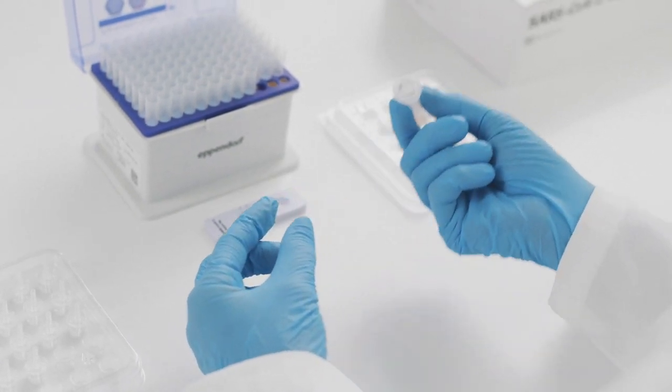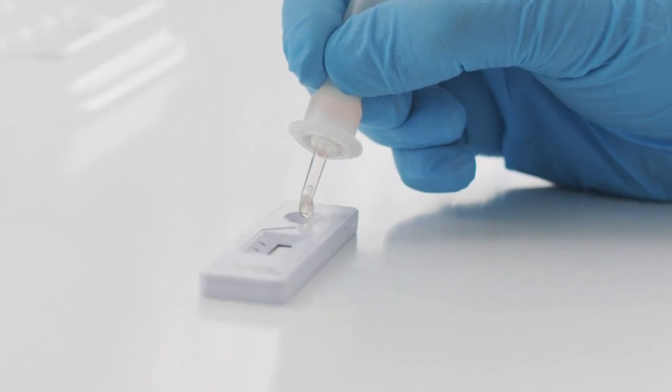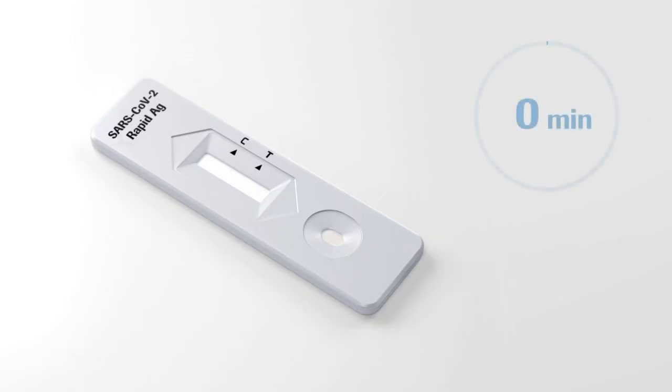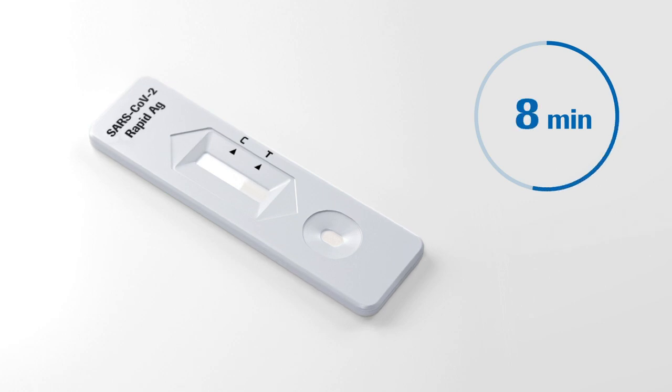Turn the tube and apply three drops of the extracted sample to the specimen well of the test device. You can now wait for the test results. For accurate results, allow 15 minutes to read the test. Do not read the test result after 30 minutes to avoid the risk of incorrect results.